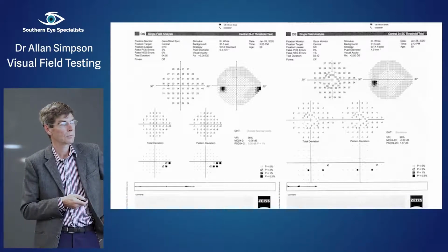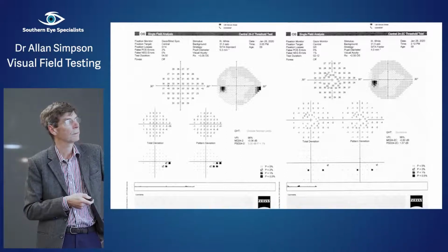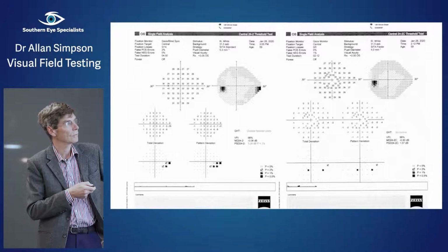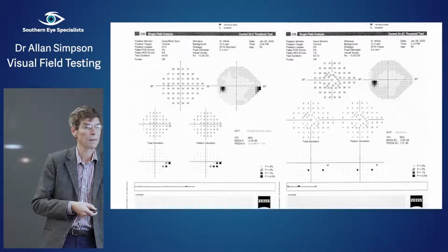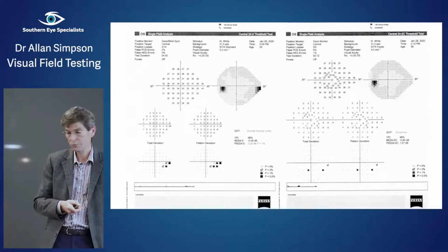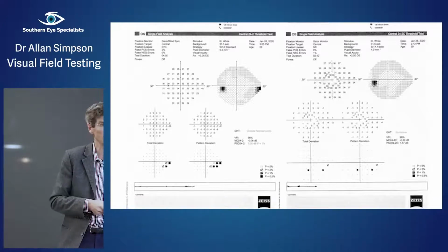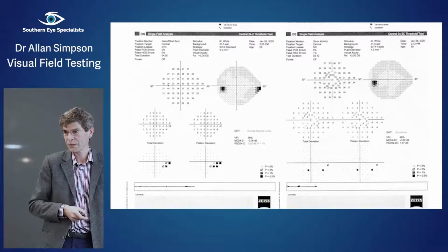So that one's a little bit of a worry that we might be missing something on this machine, that we were picking up previously. And again, you see the difference in testing time, just over 2 minutes versus 4 minutes. So roughly half testing time we're doing in all of these tests, which patients love. It's great for patients and great for office efficiency and great for everything, so long as we can be confident in these tests.